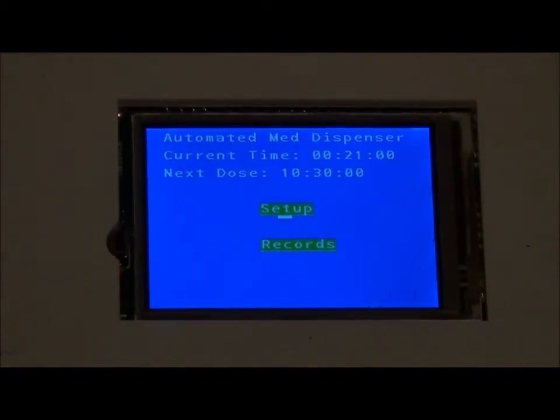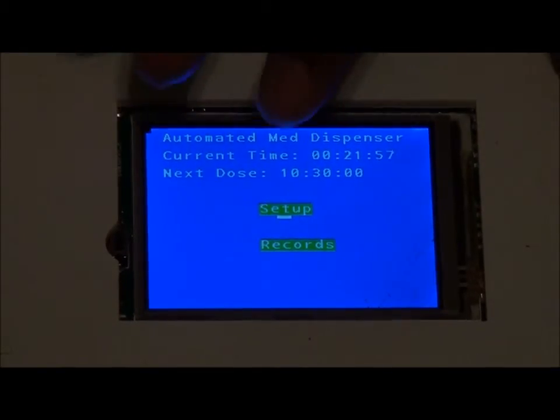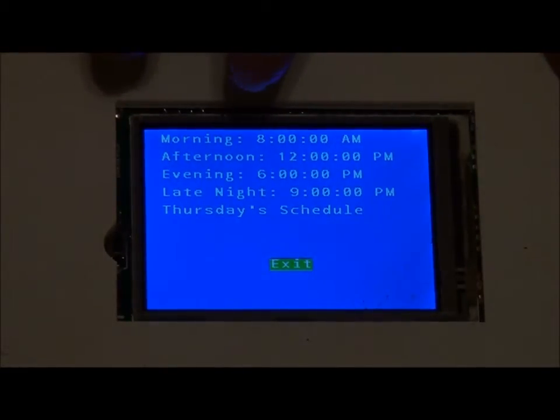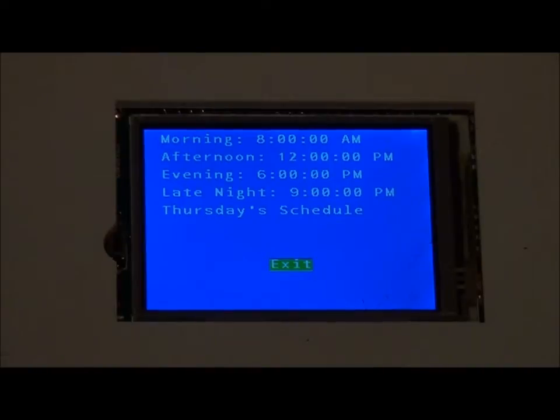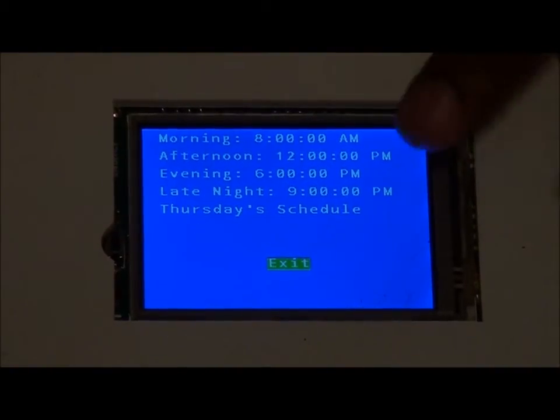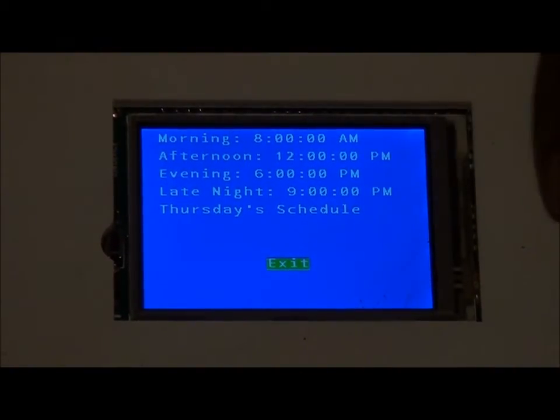Now that you've filled up your AMD with medication, you want to set up the appropriate times. To do so, you simply select the setup button, and you select the particular date which you want to set up. This is an example of Thursday's schedule. To adjust the time, you can simply select the buttons.